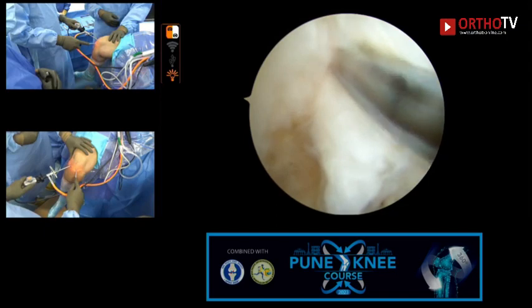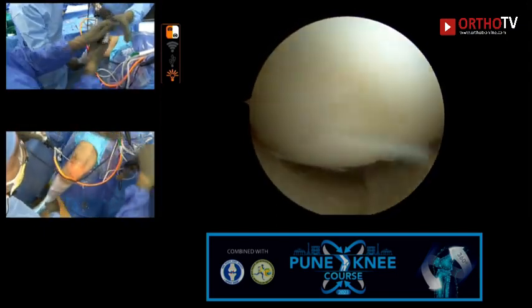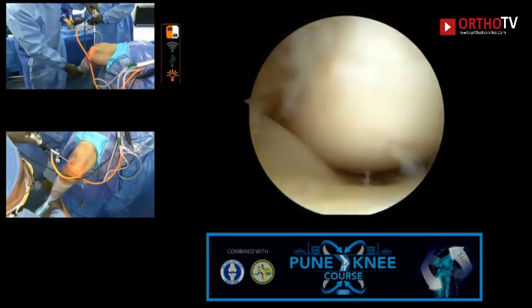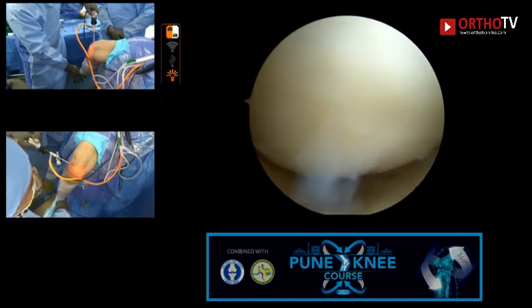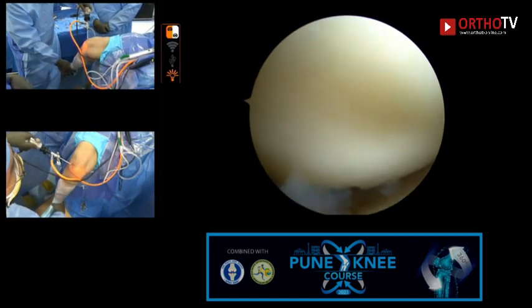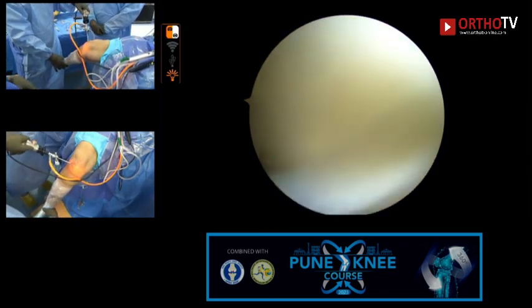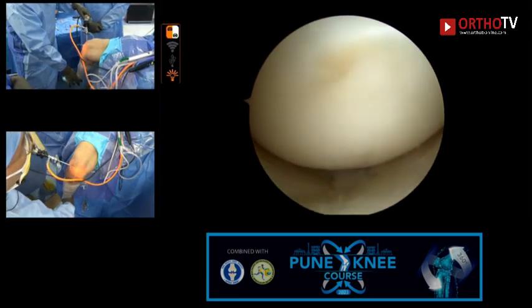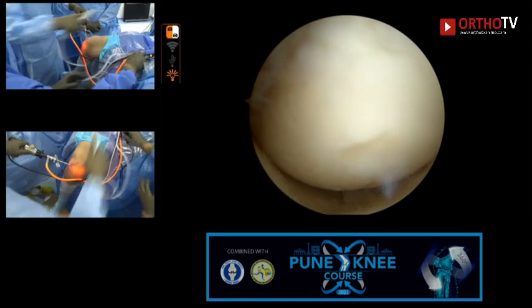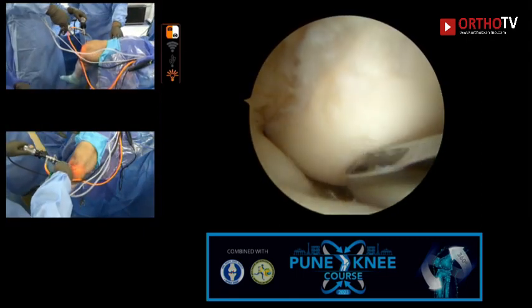Yeah, so the other thing is that for the body, you just need a little less opening and you can see. And just one other point is that the meniscus was injured for a while, so the cartilage here is quite crummy. And so we have a grade 1 chondral lesion throughout the medial condyle. As you can see. In truth, when you get a degenerate meniscus like this, it's the beginning of degeneration of the whole medial joint. It's the beginning of the end, really. So you're up against it, no question.